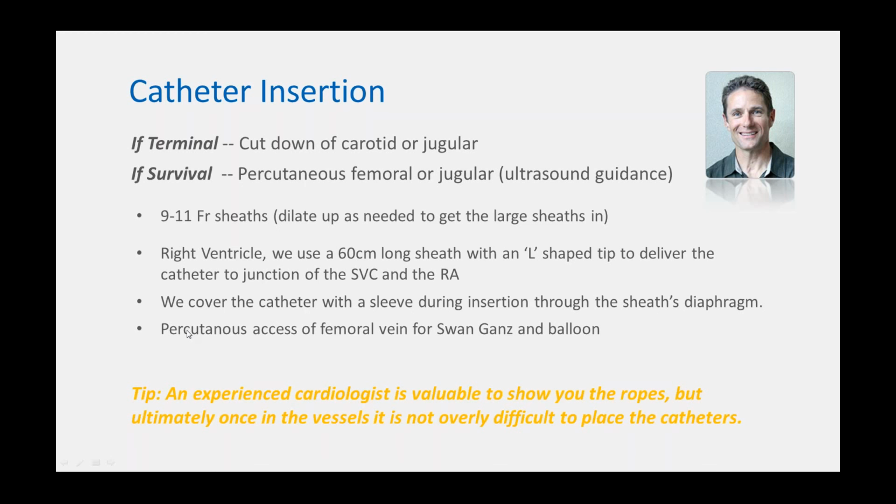We do percutaneous access of the femoral vein for the Swan-Ganz balloon. We found that an experienced cardiologist is going to be really valuable to show you the ropes once, in terms of how you get percutaneous access, how you manipulate wires and catheters into place. But once you've seen it once or twice, it's really pretty easy to do, and particularly it doesn't necessarily take a lot of surgical skill in these cases to set up a pig. So don't be afraid to try this at home, I guess.